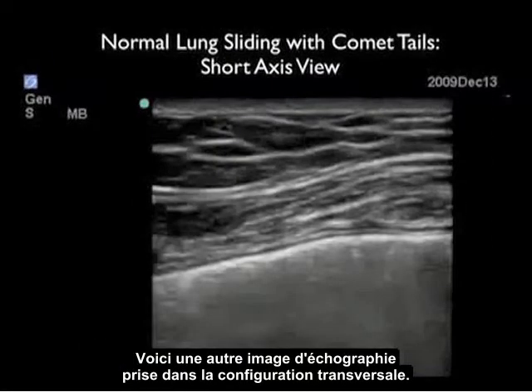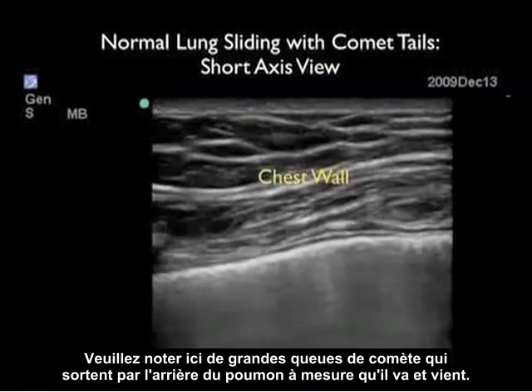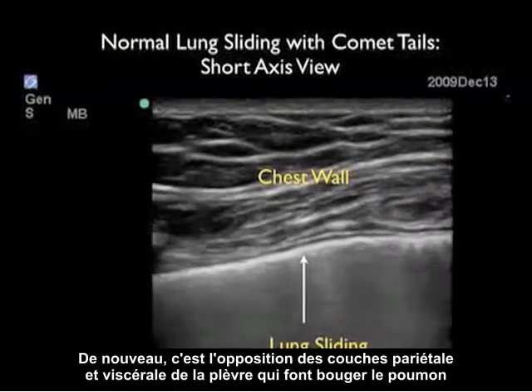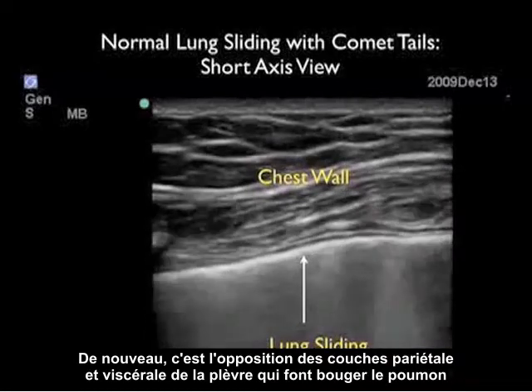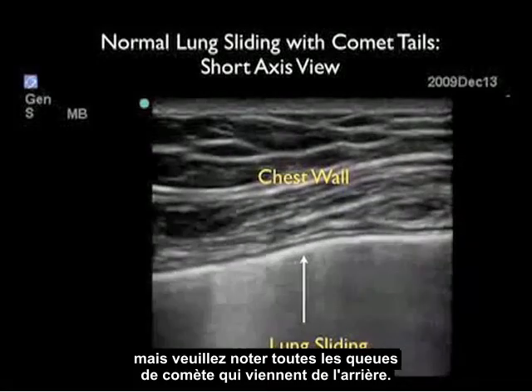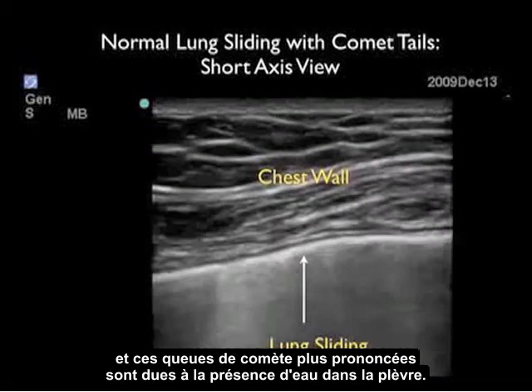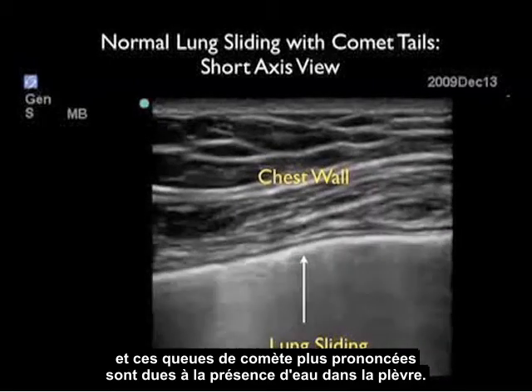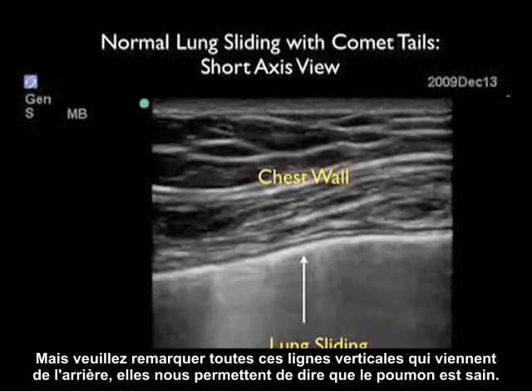Here's another ultrasound image taken from the short axis configuration. We see very prominent comet tails coming off the back of the lung as it slides back and forth — that opposition of the parietal and visceral layers of the pleura that allows the lung's shimmering. In this case, this patient had some pulmonary edema, and these comet tails are more pronounced due to the presence of water within the pleura. But all these vertical lines coming off the back tell us this lung is up.